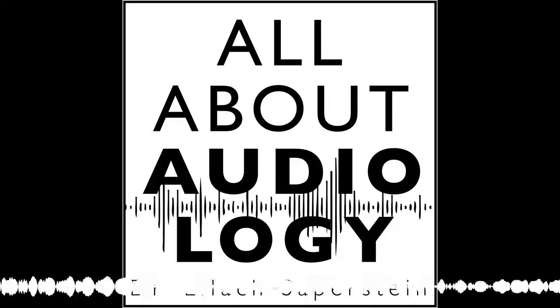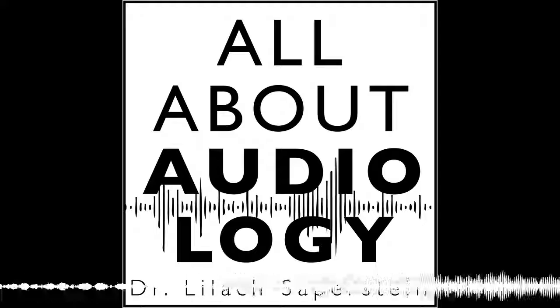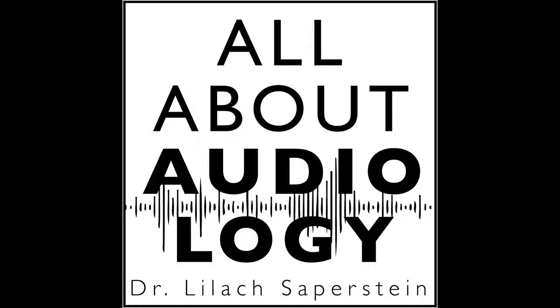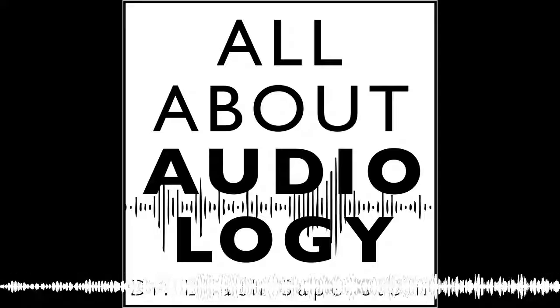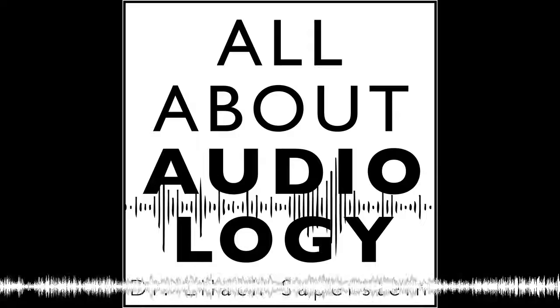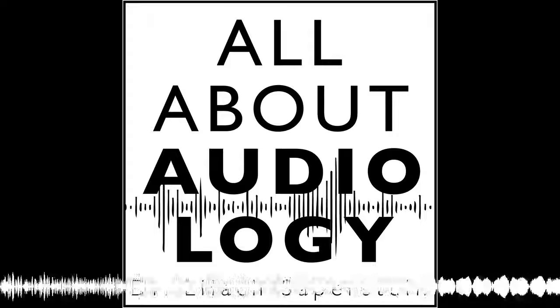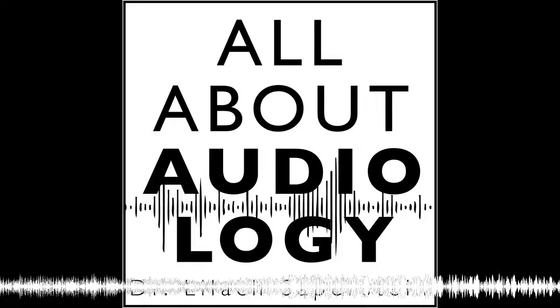And I think what's really interesting about it that people don't always, maybe for the students out there listening, appreciate is that this is all about pressure stimulating the vestibular system. It's not based on anything auditorily, which is interesting because you're putting a loud sound in their ear. And your immediate reaction is, oh, well, it's the sound that they're responding to. And in fact, it's the pressure disturbance in the vestibular system. So someone who's deaf can have a vestibular evoked myogenic potential. So I think that's an interesting aspect to keep in mind when students are learning about vestibular evoked myogenic potentials.